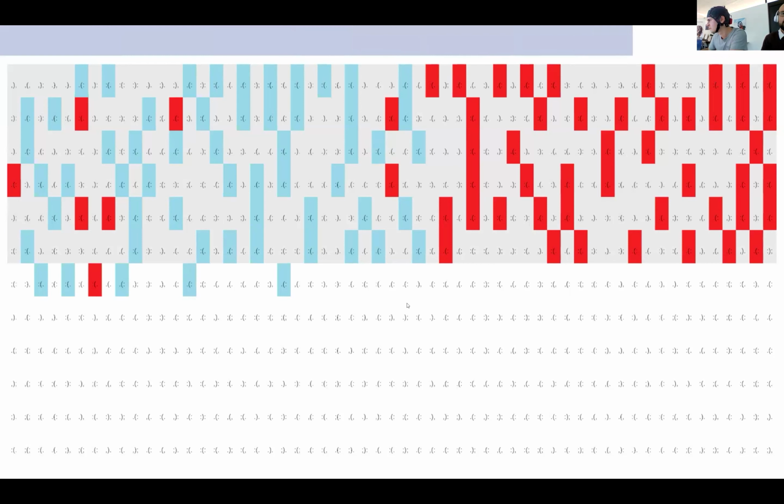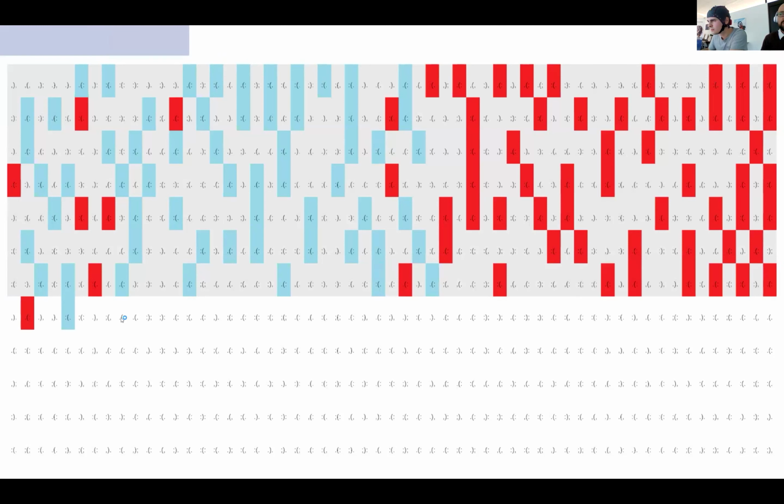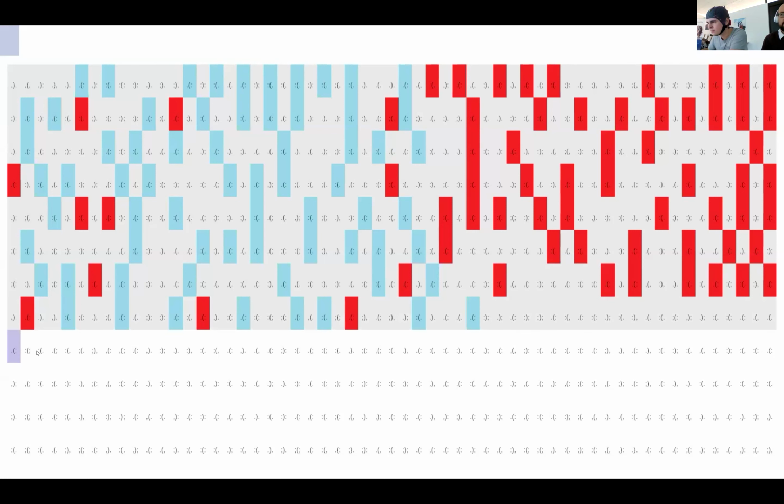But in principle, you could use the classifier as you wish. You can classify one by one, merge the data together, do an averaging, or do a median of the results. It's highly dependent on the outcomes that you want.